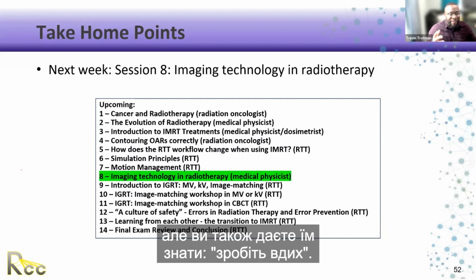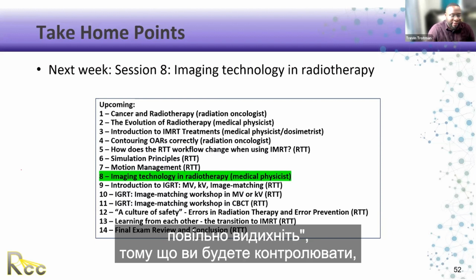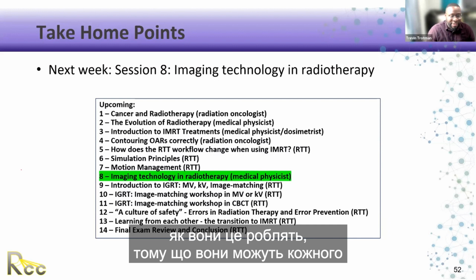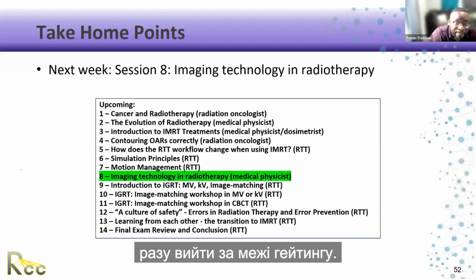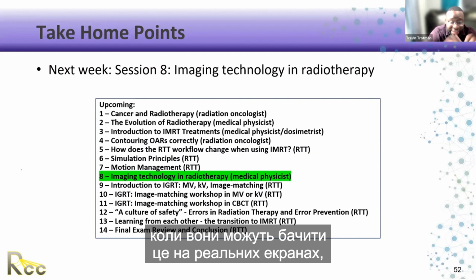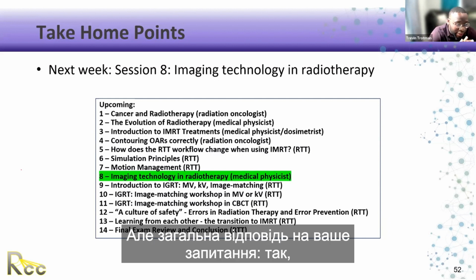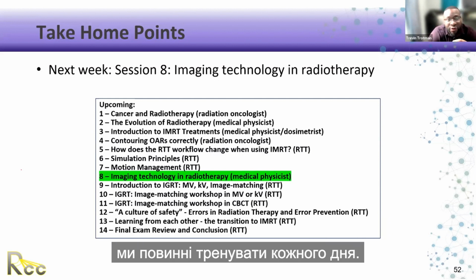It doesn't have to be the big speech every day, but you're also letting them know, take a breath in. You want to tell them, take a slow breath in, hold there, take a slow breath out, because you're going to be controlling how to do it, because they can overshoot the gate every time. But with the innovations with the VCD now, where they can actually see the gating on the computers, that helps big time too. But the overall answer to your question, yes, we should be coaching every day.